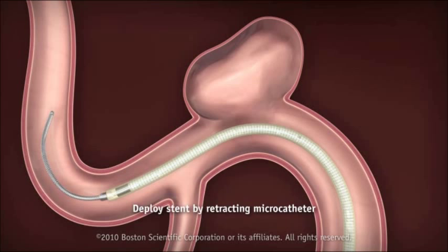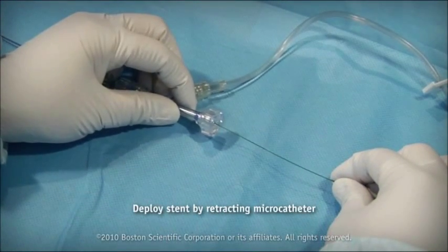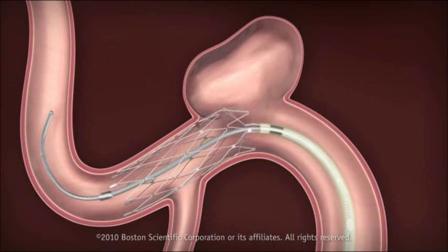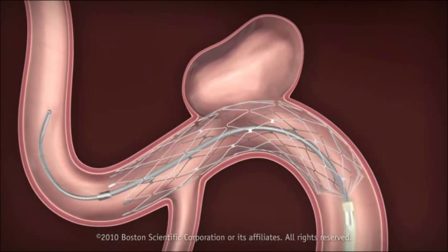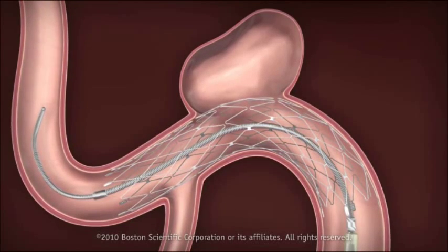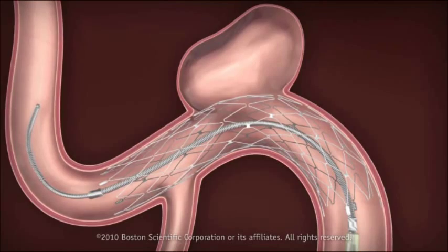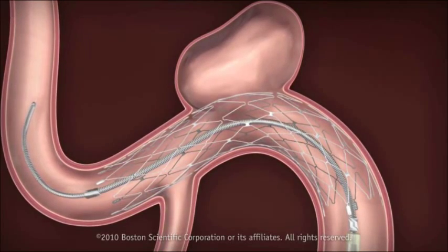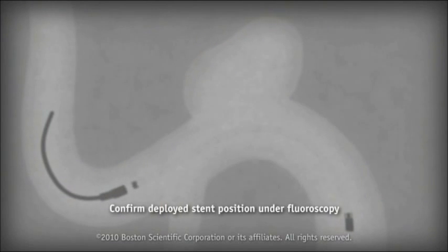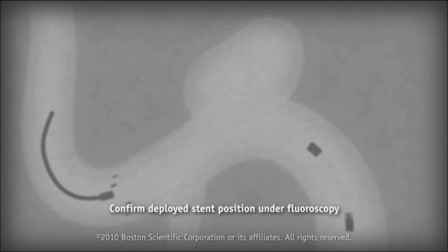When the stent positioning is satisfactory, deploy the stent by carefully retracting the microcatheter while maintaining the position of the stent delivery wire. It may sometimes help to maintain some forward pressure on the stent delivery wire to ensure it stays put. Do not use the stent delivery wire to push the stent out of the microcatheter while deploying. The stent's distal and proximal markers will expand as they exit the microcatheter.